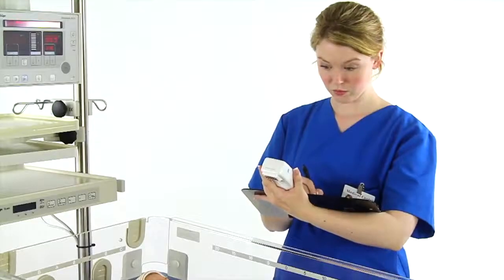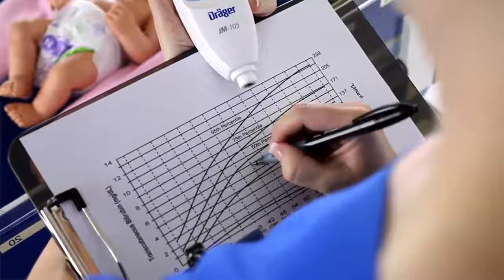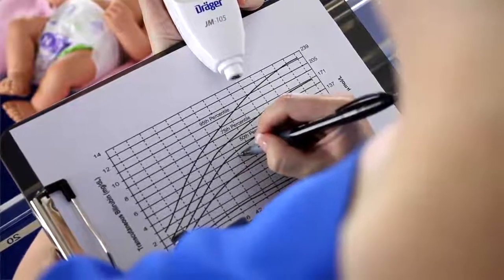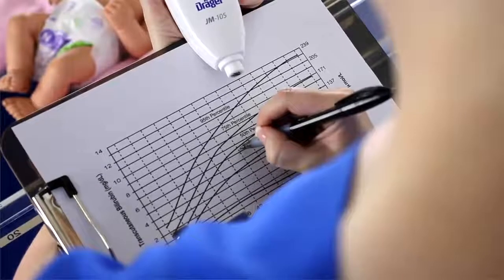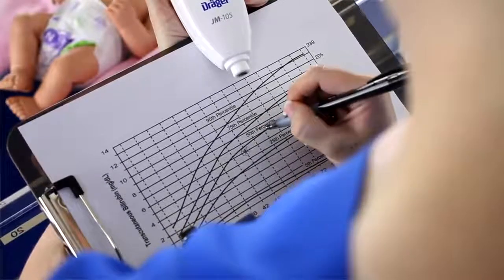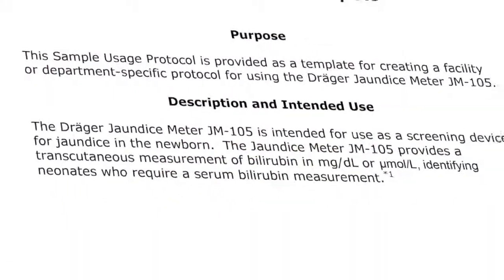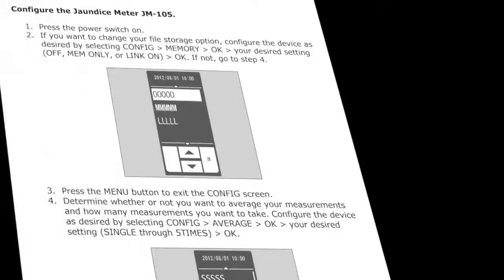Many hospitals and physicians' offices plot the JM105 readings on a graph called a nomogram, like this one. The transcutaneous bilirubin value is plotted according to the baby's age in hours and can assist in determining which babies require a laboratory bilirubin test or further follow-up. Refer to the JM105 sample usage protocol for more information.